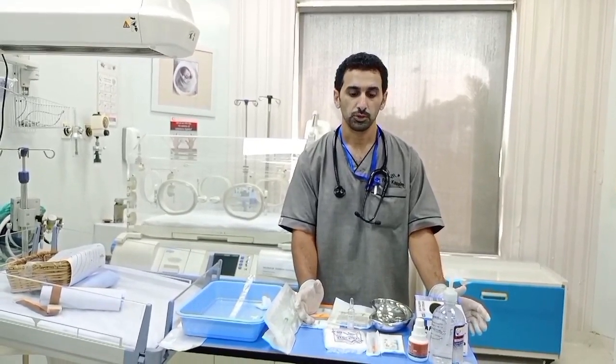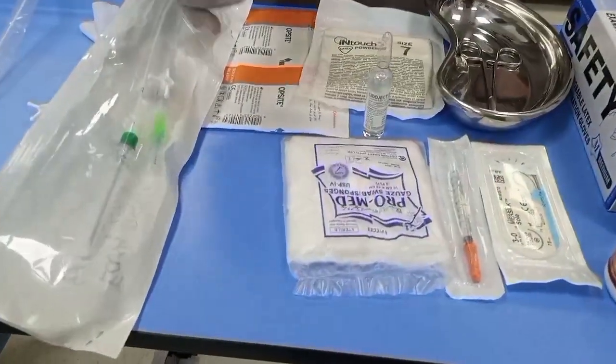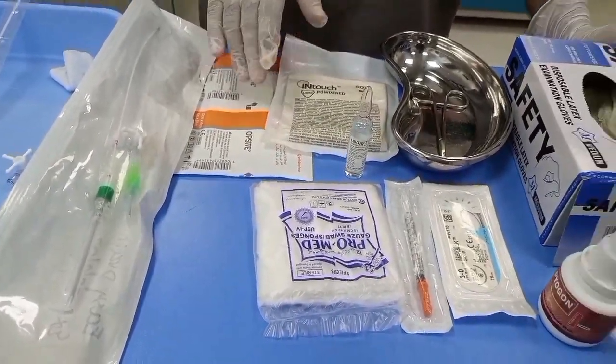After identifying the need to insert the chest tube, you should gather your instruments, which should include antiseptic solution, three-zero stitch, lidocaine one percent, sterile gauze, surgical gloves, and an Opsite, needle holder.